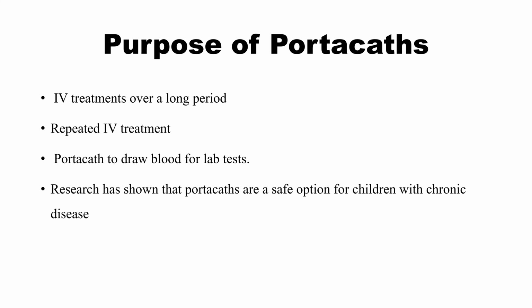Purposes of Portacaths. Ports can be useful when people need frequent IV treatments over a long period, such as for chemotherapy. Repeated IV treatment involves a lot of needles, which many people find uncomfortable. It can also be challenging for healthcare staff, who sometimes have to spend time searching for veins. Inserting a Portacath removes these issues as it establishes a direct pathway into the person's vein. Healthcare professionals can also use a Portacath to draw blood for lab tests. Research has shown that Portacaths are a safe option for children with chronic disease.